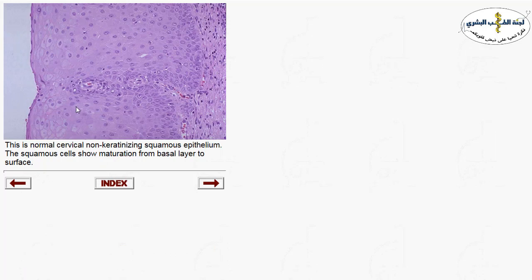The uterine cervix is composed of ecto- and endocervix. The ectocervix is lined by squamous epithelium and the endocervical portion is lined by columnar epithelium. You can appreciate the maturation from the bottom of the epithelium up to the surface of the squamous epithelium. This maturation is important because dysplasia disrupts the normal squamous epithelium.